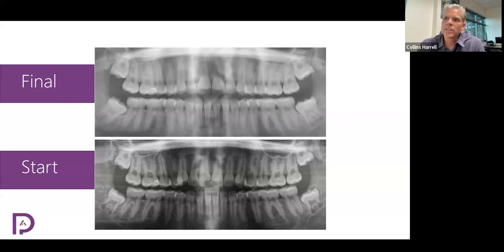Comment here online that they would like to have seen the lower black triangle treatment since she's young. And yeah, some of you may have gone ahead and treated that black triangle in the lower arch, which would have been completely acceptable.